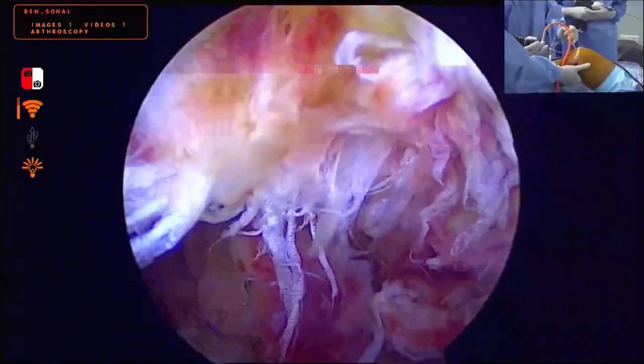If you do this properly and if you do this as I have told, you will not regret. It is a very good procedure to repair the ligaments as compared to doing a reconstruction, because they are coming to you at the right time. So this lady came to me at 7 days of the injury, so she was at the right time where this procedure can be done. You can see the MCL opening is almost not there. Preoperatively, it was almost a grade 3 opening. The MCL was going into gross laxity, but there is nothing there now.